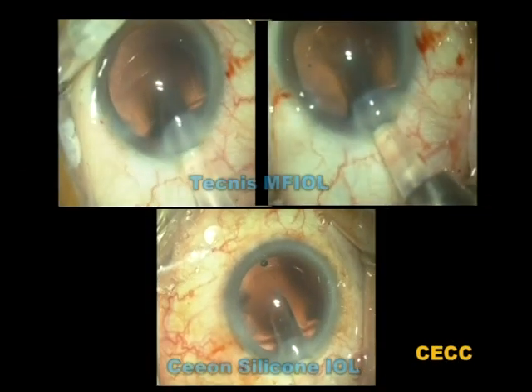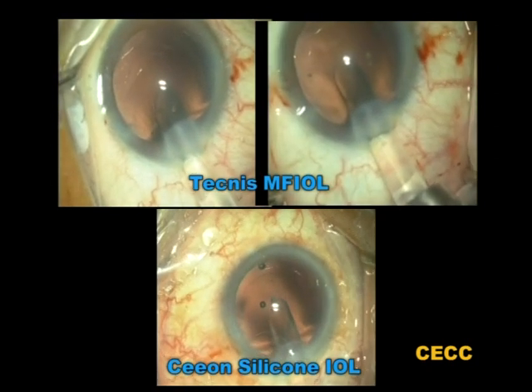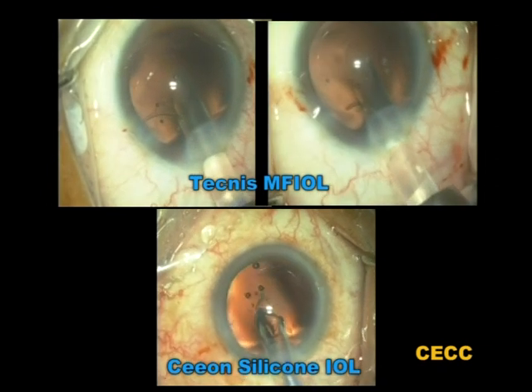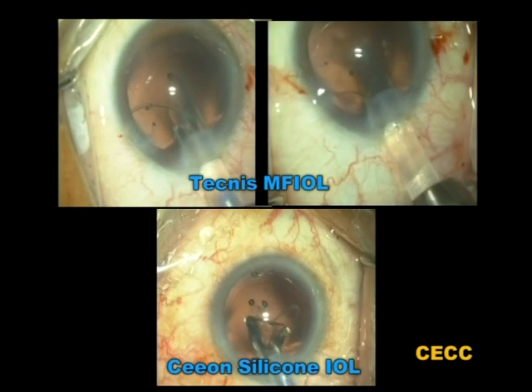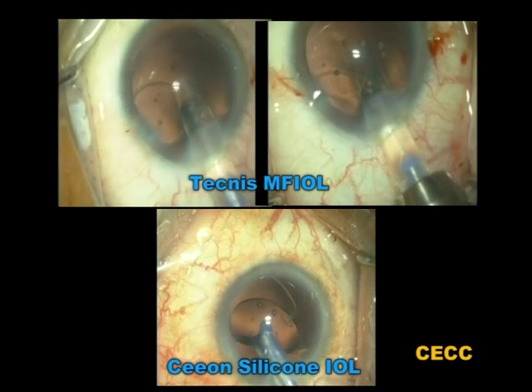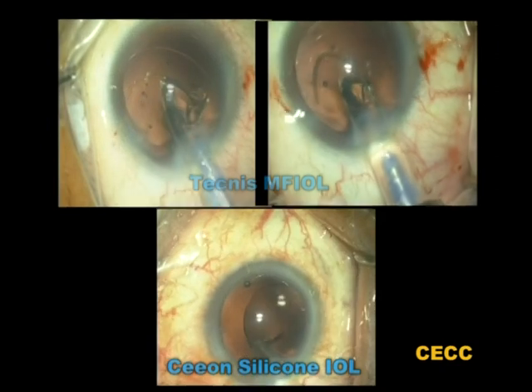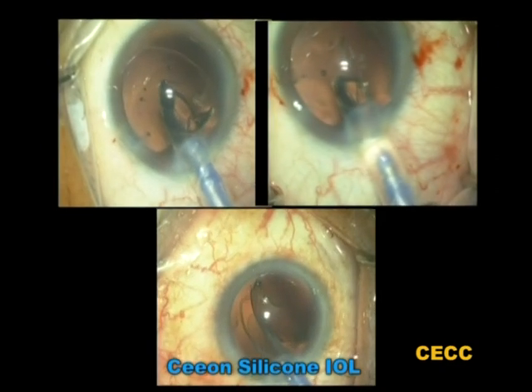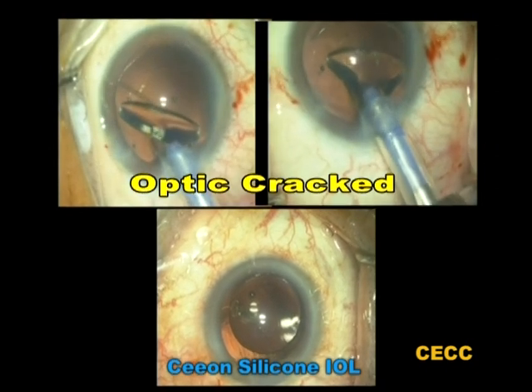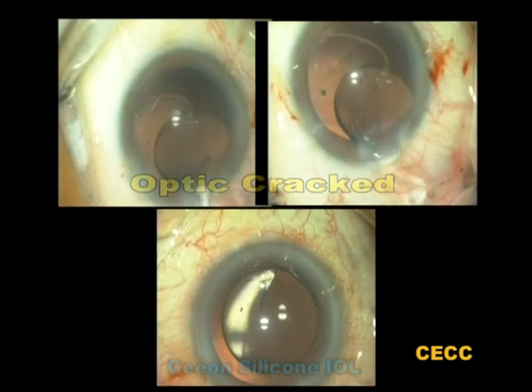This combination of clippings shows the insertion of Tecnis multifocal intraocular lens and the Xeon silicon intraocular lens using the Silver series system. This lens design, when launched, was meant to be implanted using the holder-folder forceps. For convenience, it became a custom to deliver the lens using the Silver injector series. The IOL optics cracked in each case. These problems could have been avoided if a proper and appropriate implantation system had been employed. These IOLs were exchanged with similar designs using the appropriate implantation system.